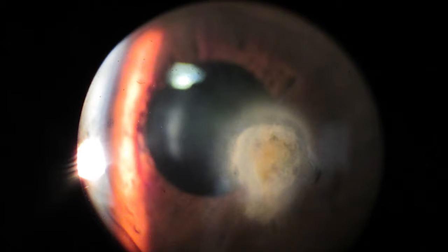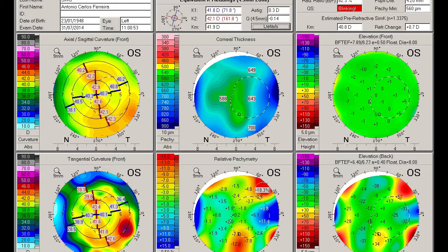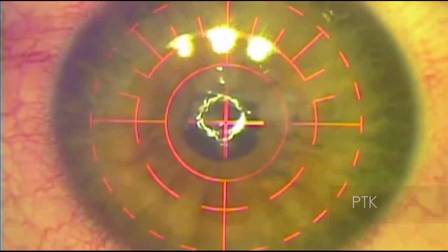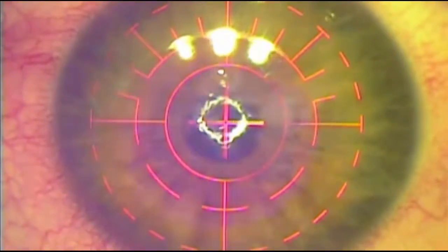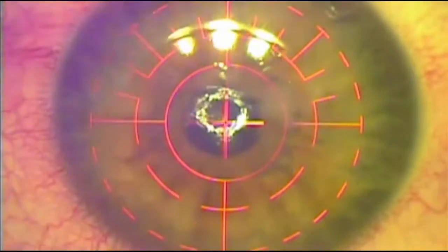Identifying the scar's impact on the shape of the cornea as well as its degree of opacification are keys for deciding the best course of action. The advent of corneal tomography has helped us tremendously in determining the best surgical strategy. Superficial keratectomy and excimer laser PTK are viable options for cleaning the cornea prior to cataract surgery. Afterwards, one can easily correct for changes in the corneal curvature with the IOL power calculation.